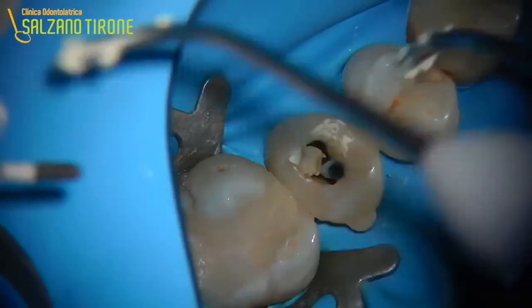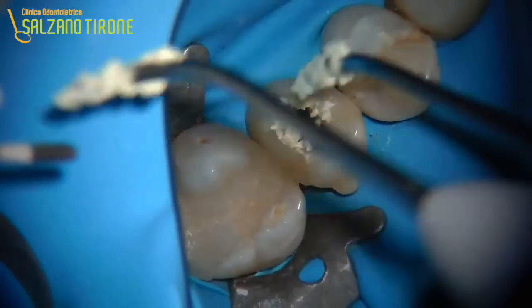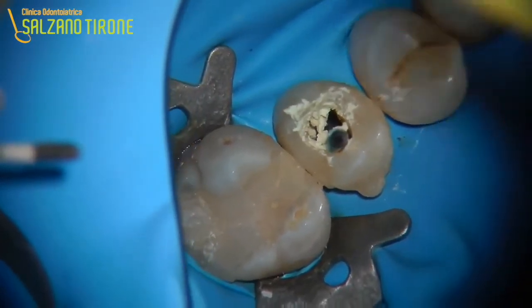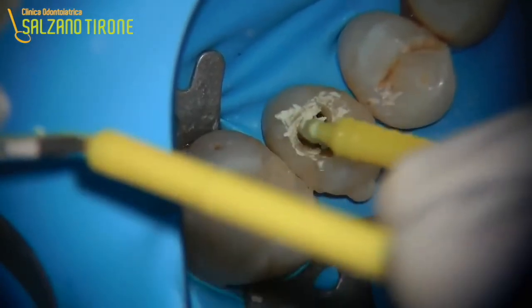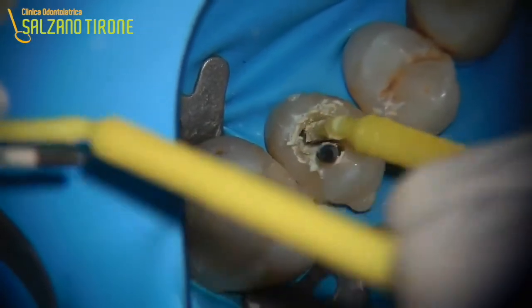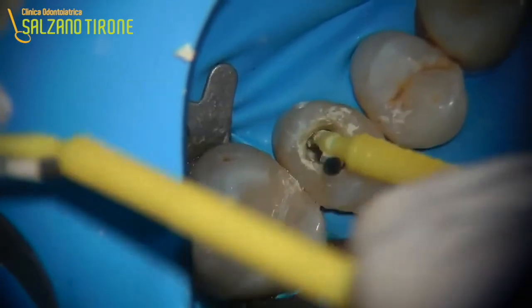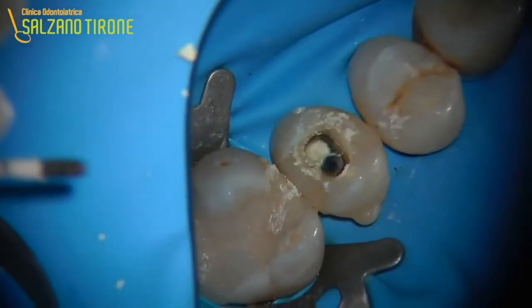Then I start placing some MTA and I prefer to adapt it with some little brushes. Honestly, I never manage to work well with the MTA gun, which always gets stuck, so I put the MTA at the edge of the cavity and I push it down with a brush. Do this several times until you feel all the cavity. Then, as we know, the MTA needs to be in wet environment for 24 hours to harden at its best. So at the end of this procedure, we will cut and remove the paper cone that we had put as soon as the MTA started becoming solid.